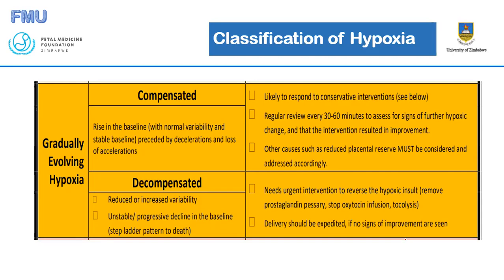I'm not sure if there's anyone with questions so far concerning the CTG. If there are, you can either unmute and ask your question, or write the question in the chat box. Sorry, Dr. Verenga, thank you for your presentation. I don't know if I missed it, I came in a few minutes late, but I just wanted to ask about the use of CTG, what they call an admission CTG. Is it of any use in patients who are coming in just for a routine admission CTG where there is no risk assigned to the patient?